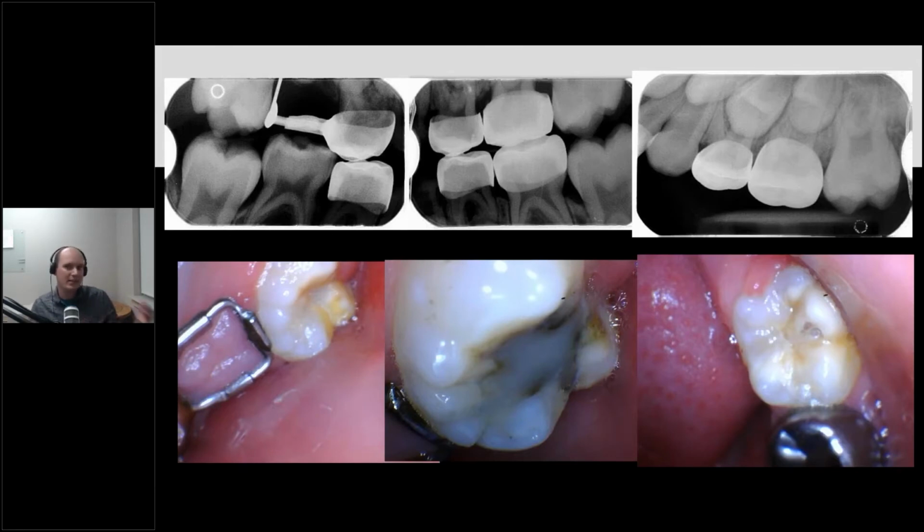You're equally as viable to just use a glass ionomer in those cases, but I'm seeing the bacterial entombment from the calcium silicates, and then also the fluoride releasing, post-operative sensitivity and the mechanism of action on the bacteria that are left with the silver fluoride products. So that's kind of the direction I've headed, and it also depends on cooperation. If I don't think I'm going to be able to do the proper application and reduce the staining, then it's maybe better to use calcium silicate. Whereas if I've got a cooperative adolescent, maybe Riva Star is the way I go.